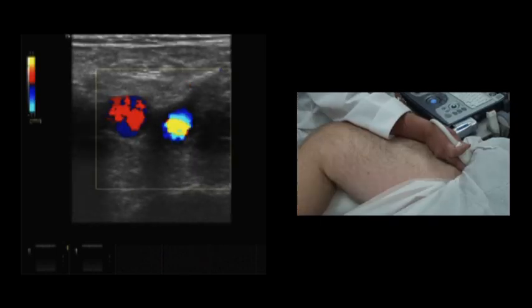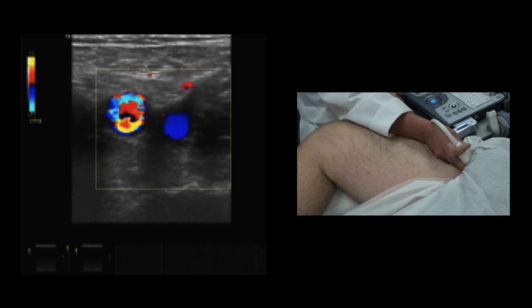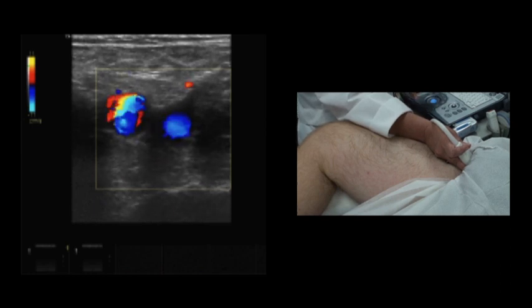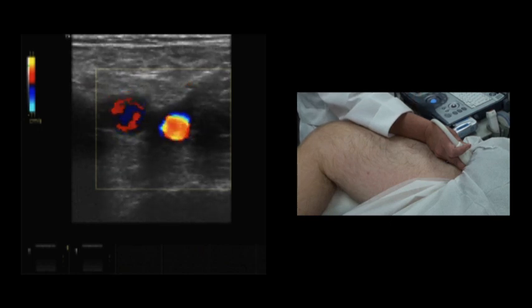We're beginning with color Doppler now, and we have the common femoral vein to the right of the screen, and to the left is our common femoral artery. Note the difference in color. Blue is representing the venous system. Red is representing the arterial system. This is another way to be able to differentiate between your vessels also.